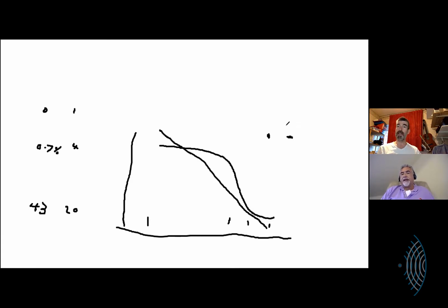Okay, I understand. Even though it could be really high, you're not going to see that big of a difference. Exactly. Whereas you can see the difference when it comes to calcifications in particular, because they cast a shadow behind them, because they block so much of the sound.